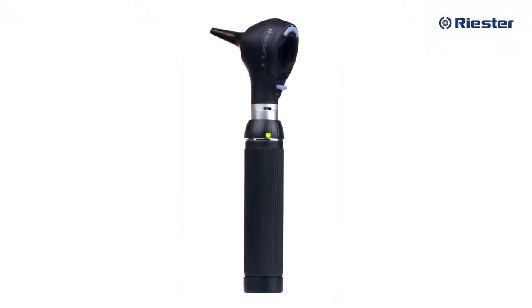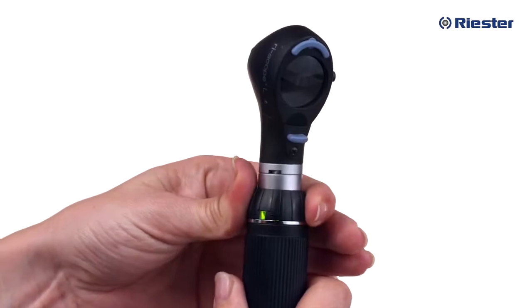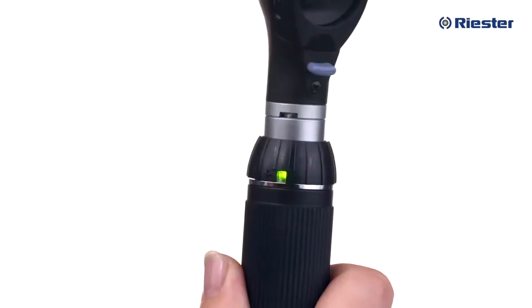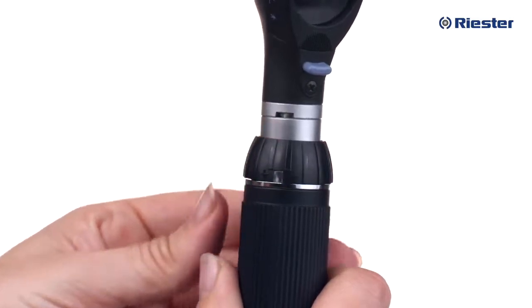Once you have connected your RiScope otoscope head and inserted the proper batteries, your otoscope is ready for use. Turning your otoscope on and off is easy. Simply twist the black collar on the top of the handle clockwise. There is a plus and minus sign on the handle. Twisting clockwise or toward the plus sign will immediately turn the device on to full power, and a green light will illuminate. To turn the instrument off, simply turn the collar in the direction of the minus sign or counterclockwise and hold until the green light turns off.